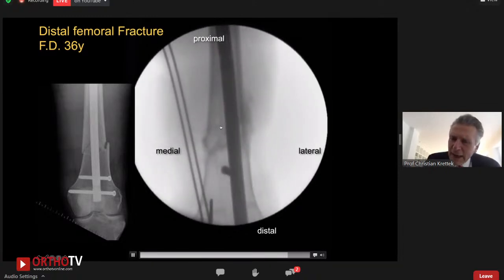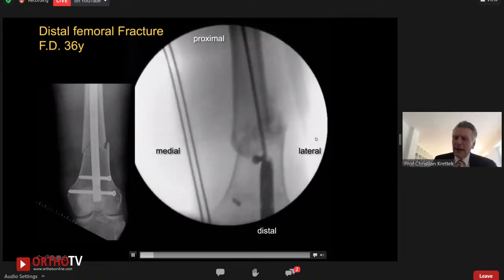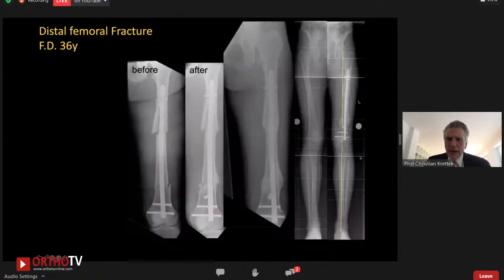And once the nail enters the proximal main fragment, it shifts the proximal fragment in the perfect position. Here, the post-operative result. Before the operation and after the operation, we see that we have a nice alignment. We can keep the alignment with the Poller screw. We can keep the implant more on the medial aspect of the leg in order to maintain a nice mechanical axis for this patient after correction, and she had a good fracture healing.